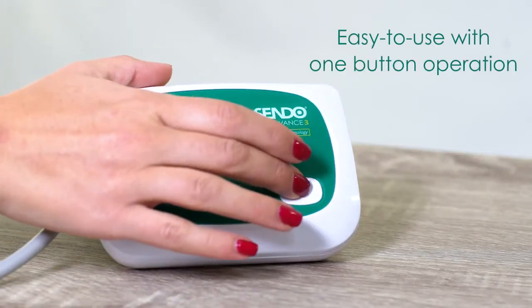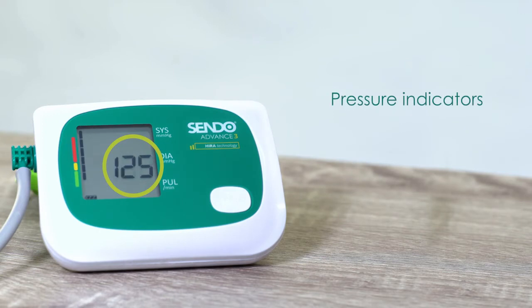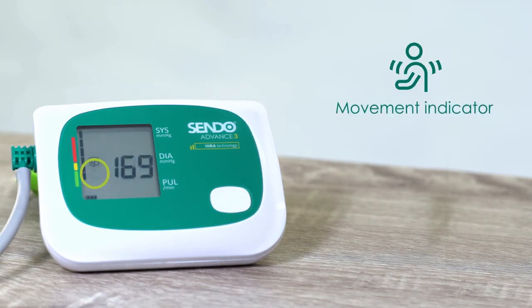Press the start button and the cuff will start to inflate automatically. The cuff error indicator will appear if the cuff is not applied correctly. The movement indicator will appear if you move during measurement.